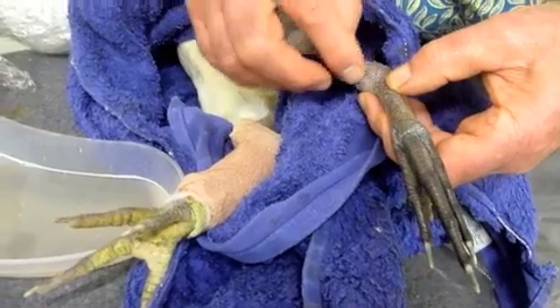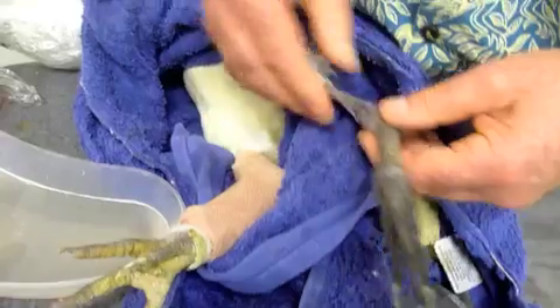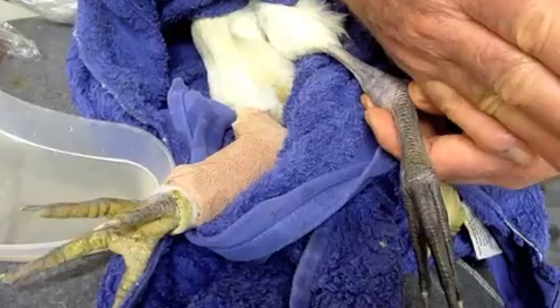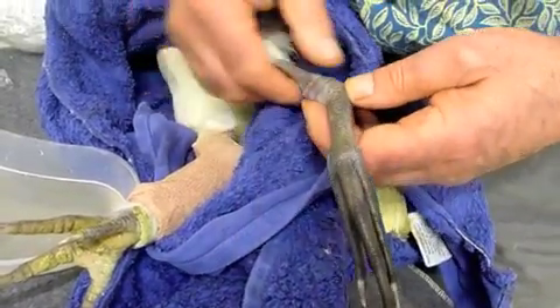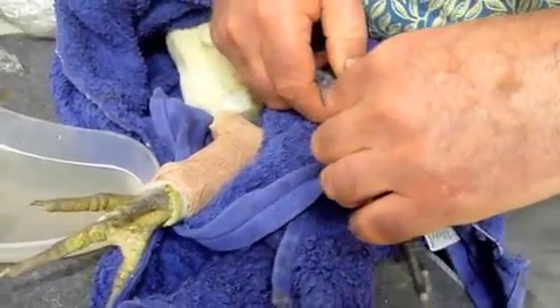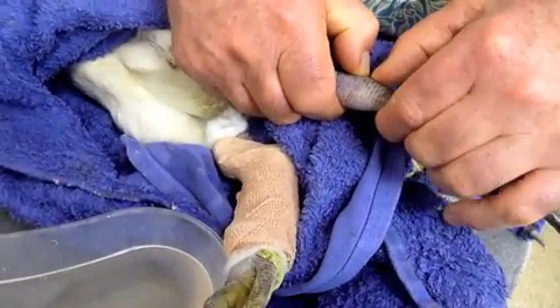The leg now has a callus across here where it's bent, broken, and deviating. This bone and this bone should be in alignment — we've got maybe 30 degrees of turning of the leg at this point. So what I'm about to do is re-fracture the leg at that point.